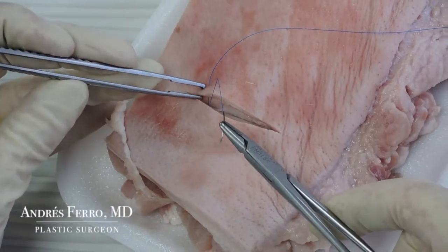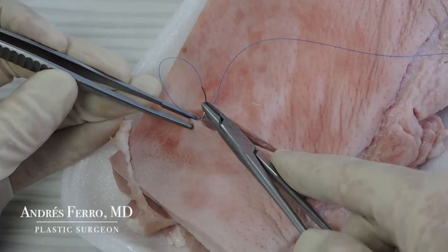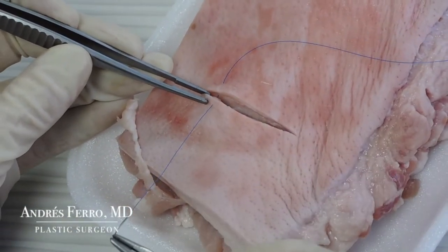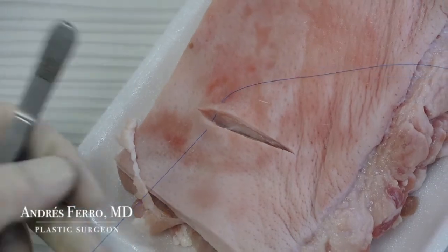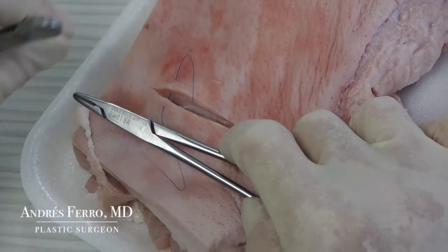Again, insert the needle into the opposite edge of the wound, at the same height as it came out previously in the dermis. Insert the needle and exit through the epidermis. Retrieve the needle with the needle holder and run the suture to leave a tail of 2-3 cm of suture.